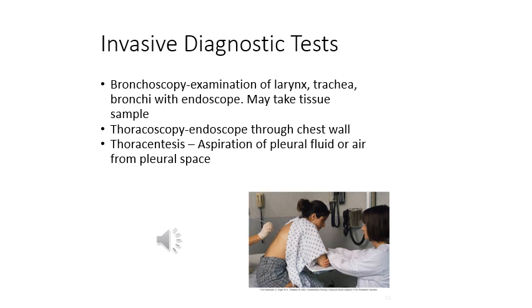And you want to make sure that you are putting your patient in the correct position when you're prepping them for this procedure. So if you bring a table or something that they can lean on, you can see in this picture, you want to notify them that the most important thing is that the patient must remain motionless. And nursing interventions is you want to monitor for signs of a pneumothorax for the first 24 hours. If there is any question, they'll do a chest x-ray to confirm.